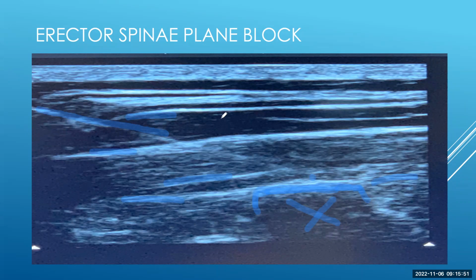So again, when we look at the different muscle layers, we can very easily delineate the trapezius muscles there, rhomboids there, and this would be the erector spinae muscles as well. So, anyways, a very good image for us to basically review ultrasound anatomy.